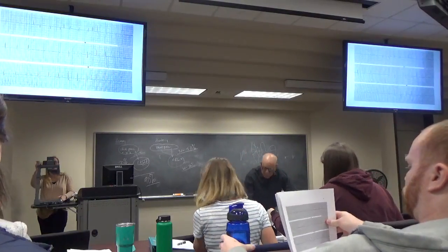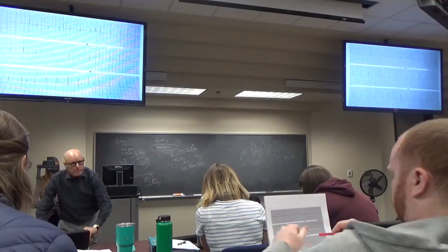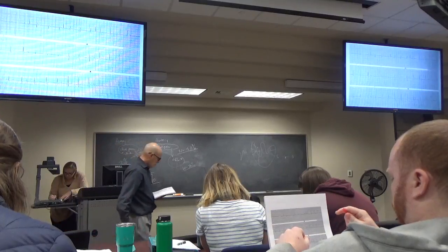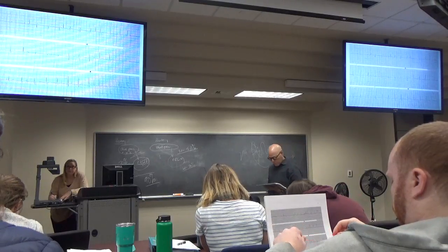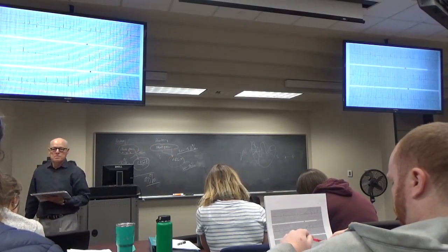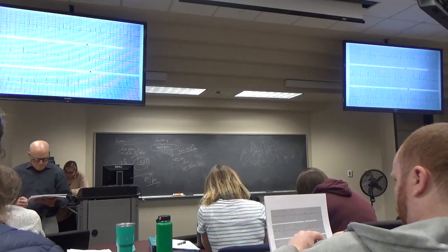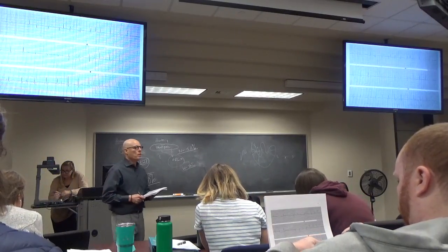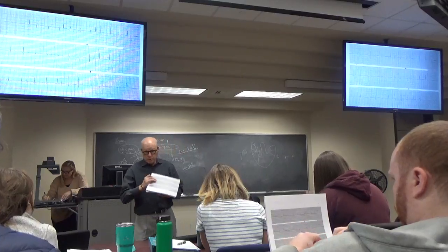Number 16? Taylor? Right. So, right now I have a heart rate of 65, PR interval of 0.12, QRS of 0.12, QT of 0.36. For axis, I got normal, about plus 75 to 80. And then I put right bundle branch block for the conclusion. Okay, so you're seeing RSR prime in V1? Yes. And what is your QRS? 0.12. And where did you find that?